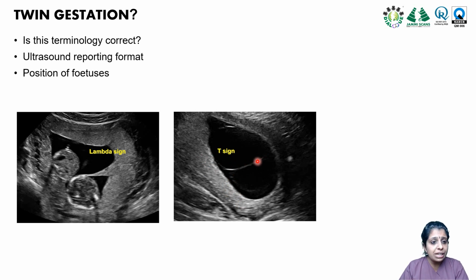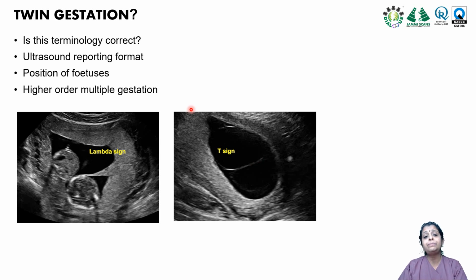The position of the fetus is also extremely important, because before fetal reduction or in any IVF or ART conception, we make sure that the fetuses are labeled in the anti-clockwise direction so that we don't remeasure the same fetus again.